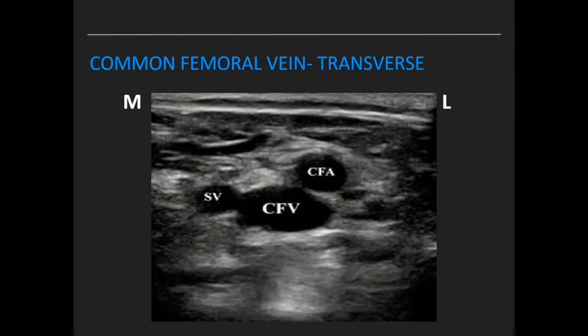For the common femoral vein, look for the famous Mickey Mouse sign where you can see the saphenous vein, the common femoral vein, and the common femoral artery.